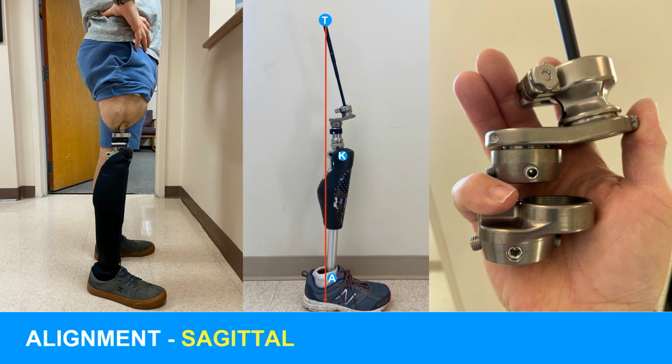We know exactly where that femur is now, so we can measure flexion repeatedly, and we can see that a patient that comes into our clinic at 22 degrees on day 1, after 10 days is reduced to about 14 degrees, and last week we had a patient within 3 weeks go from 22 degrees to -2 degrees. And that prosthetist has to maintain that alignment or continue to follow as the patient's stretching.